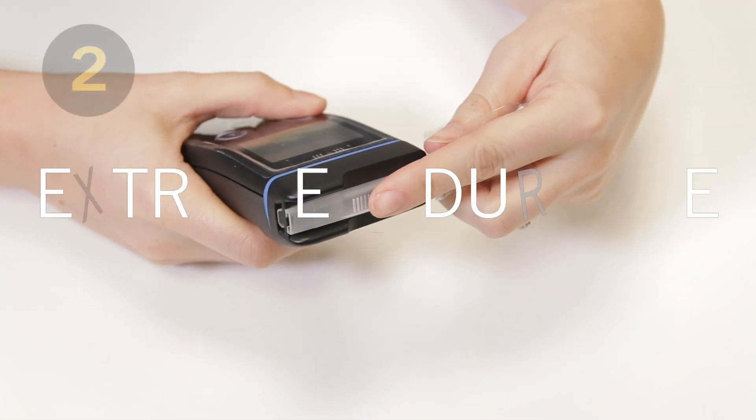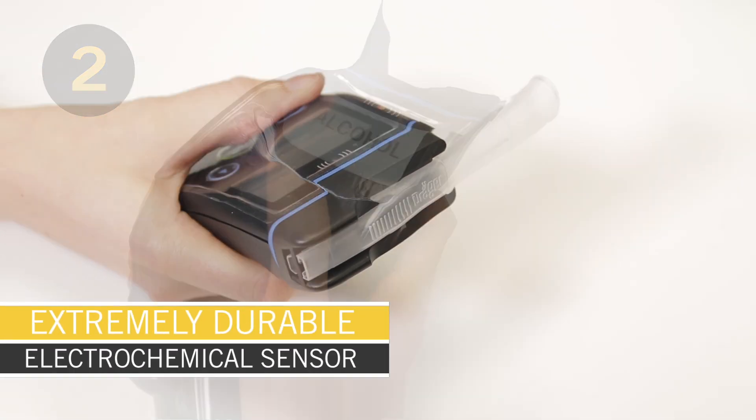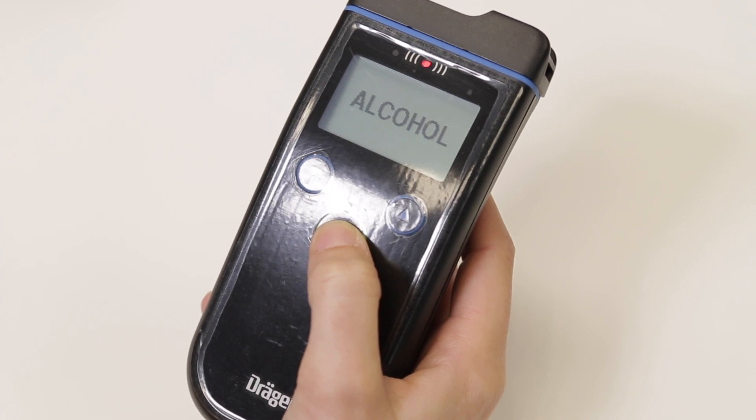The electrochemical Draeger sensor used in the Alcotest 6820 is extremely accurate and durable, and it has a very short response time which makes for quick readings.